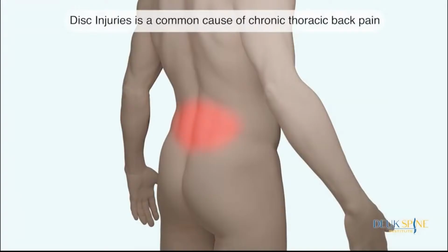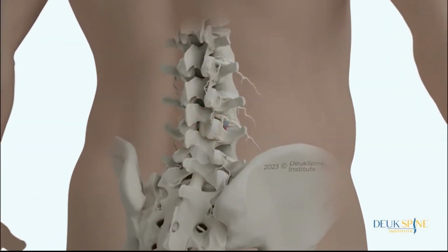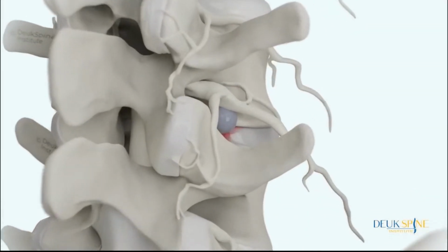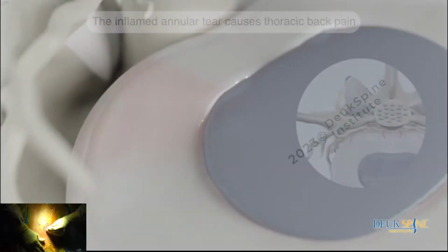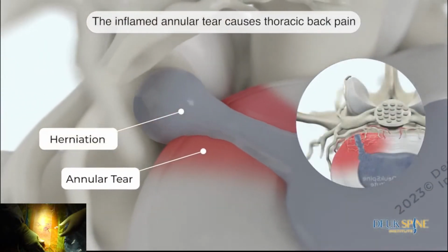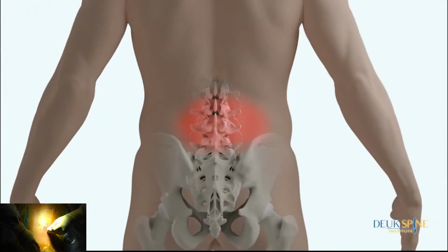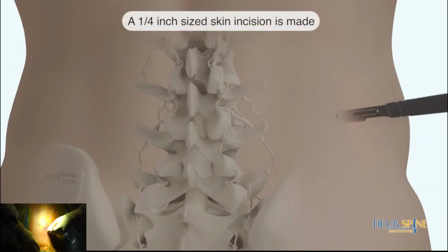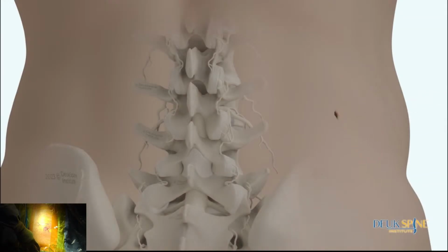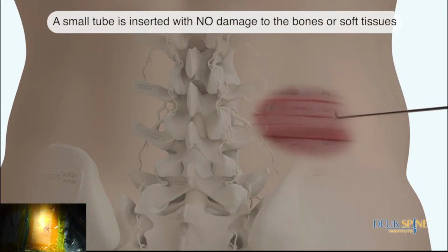Disc injuries are a common cause of chronic thoracic back pain. The inflamed annular tear causes thoracic back pain. A 1/4-inch skin incision is made. A small tube is inserted with no damage to the bones or soft tissues.